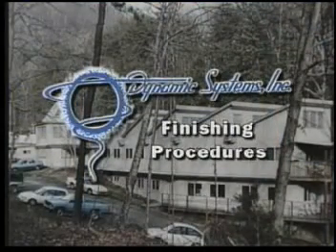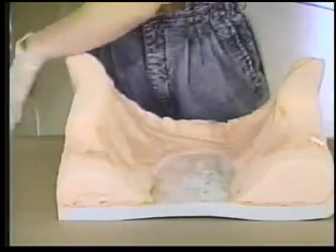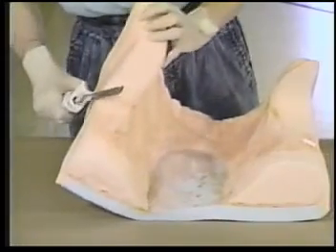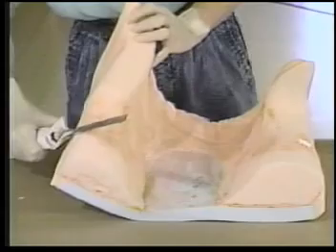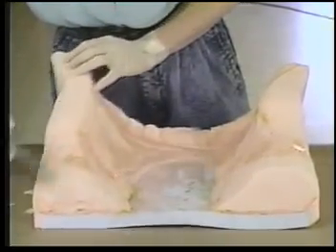Only the molded back will be used to demonstrate the finishing procedures. If the insert contains irregularities after trimming, a smooth finish can be obtained by gluing a thin quarter-inch sheet of soft SunMate laminate to the surface. It'll be necessary to trim a quarter-inch layer from the surface of the insert.